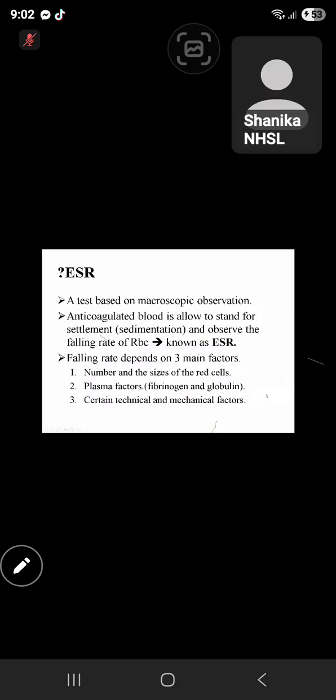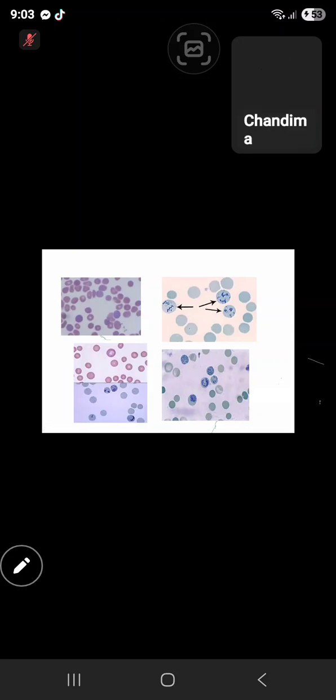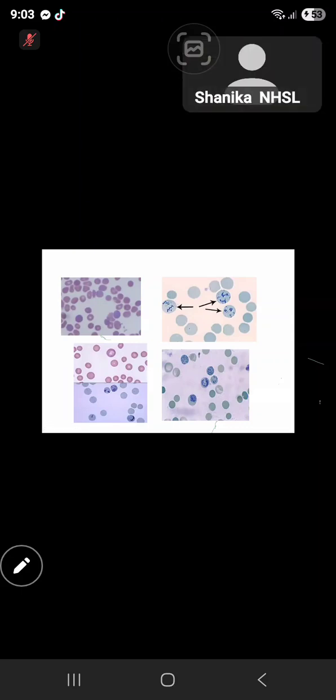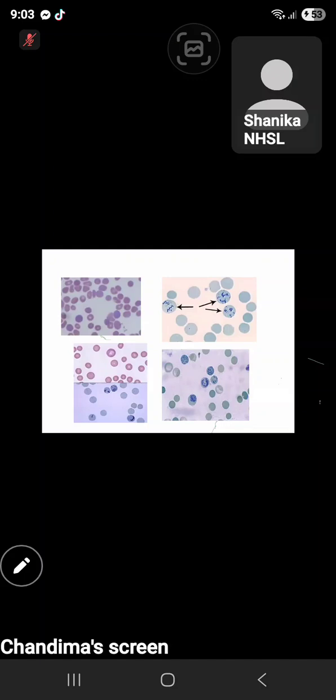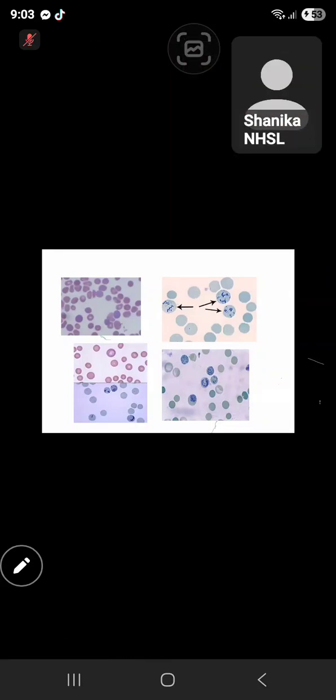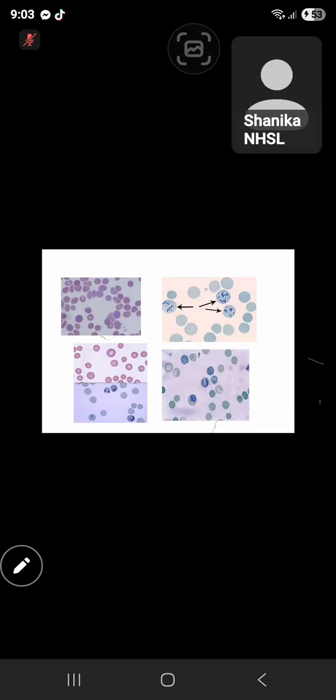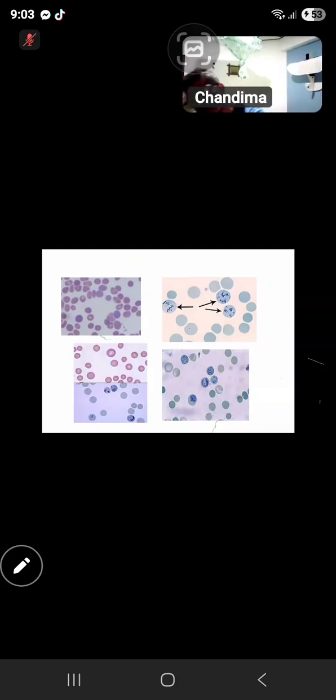My question is not regarding the reticulocyte count. You previously mentioned that low cell counts can be due to a hemodiluted sample. It can also be due to an aspiration error of the analyzer. Can we differentiate those conditions? Yes, the first thing, are you working with an analyzer? Right, so this problem is not going to be so much of an issue.